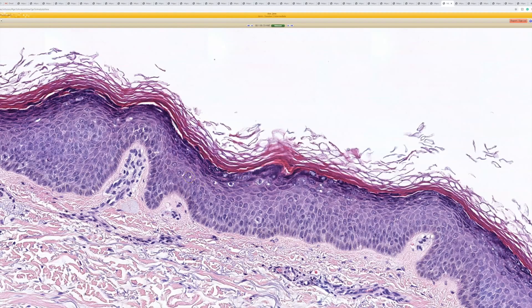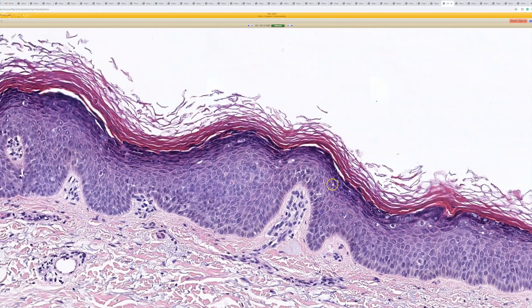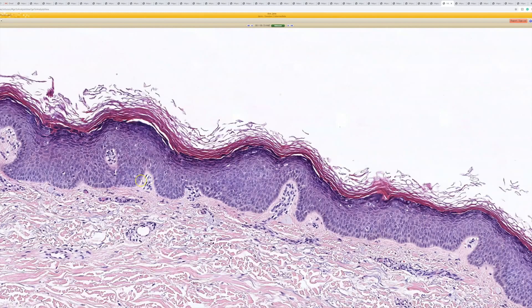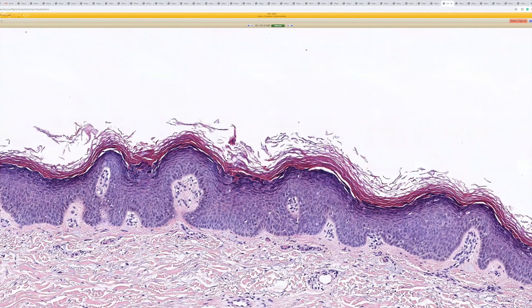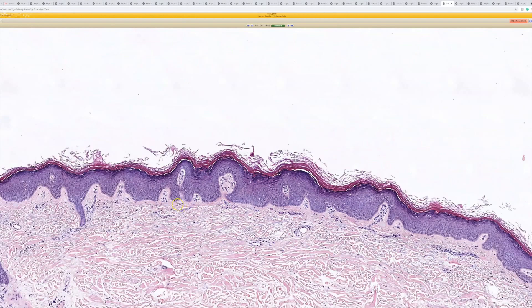I feel like Verruca Plana can have a lot of overlap with Lichen Simplex Chronicus. In LSC, you get hypergranulosis, and you can begin to get some undulation change as well.